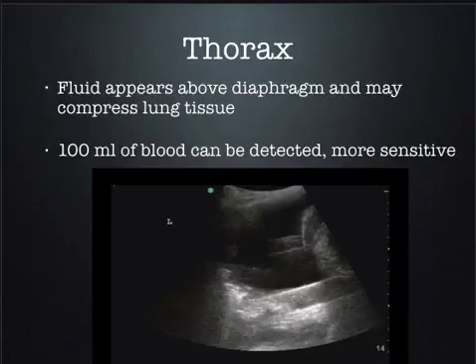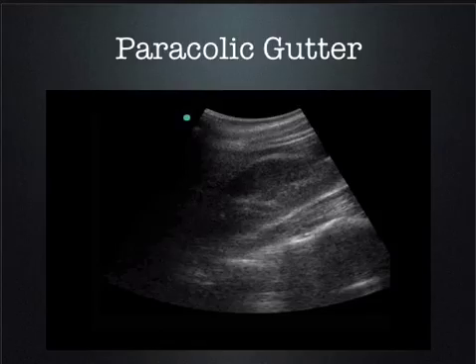What's this stuff in the fluid? What's this? Lungs. Why can you see lungs? We can't see lungs normally because they're full of air. We can't see air. But here they're collapsed, because the fluid has pushed all the air out, so this is the lung tissue without air. So this is compressive atelectasis. Everybody got that?